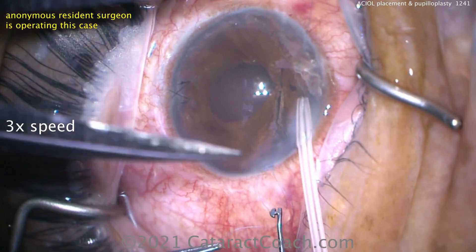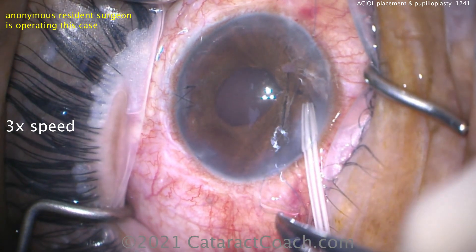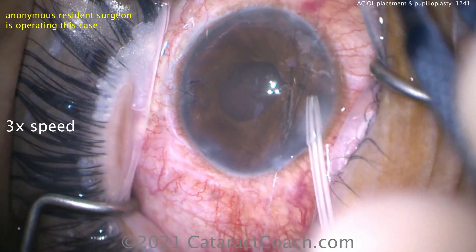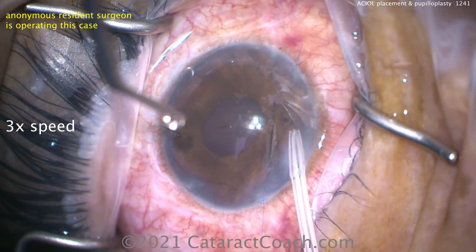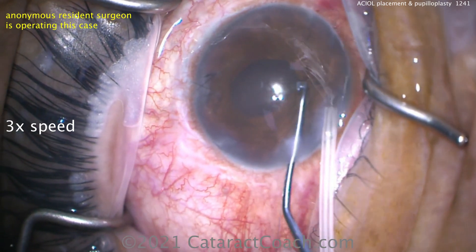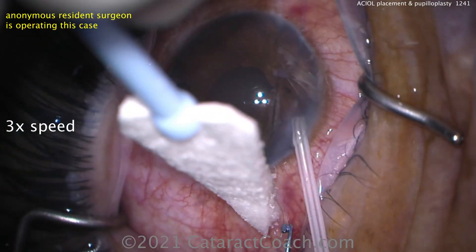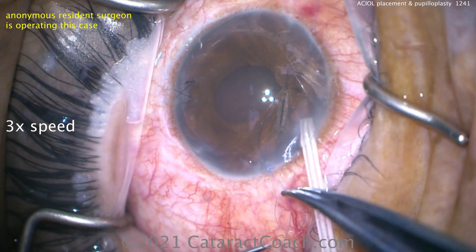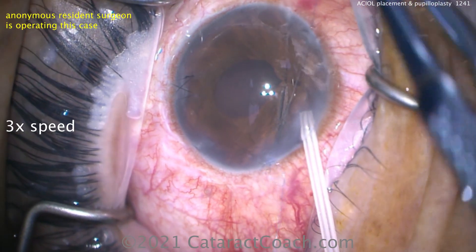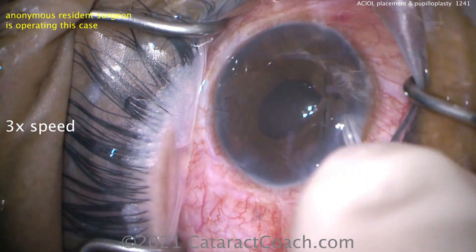We also need to make the AC lens the appropriate size. There I am measuring white-to-white with the measuring caliper. We choose the AC lens based on that, because AC lenses come in different sizes — they are angle-supported lenses. Measure the horizontal white-to-white and add about half a millimeter, at most one millimeter, to that number. That's the overall width of the AC lens you're going to choose.